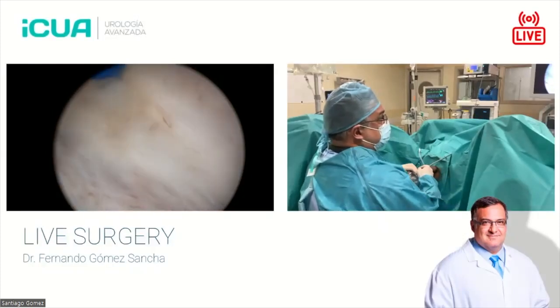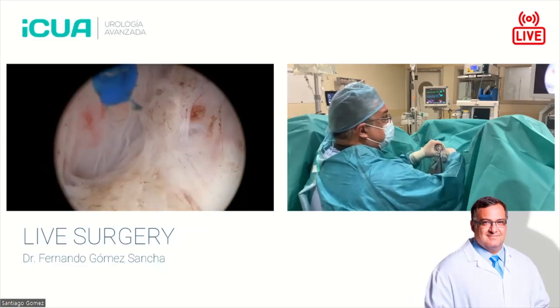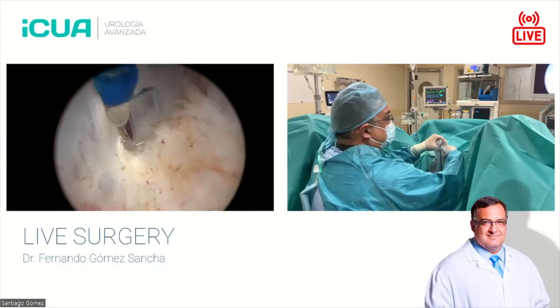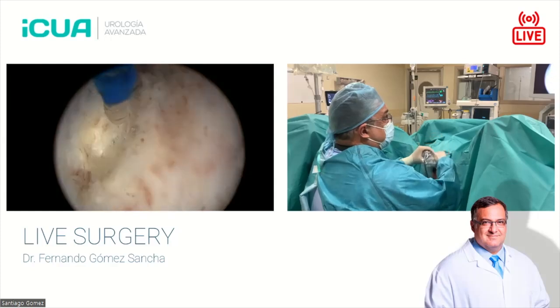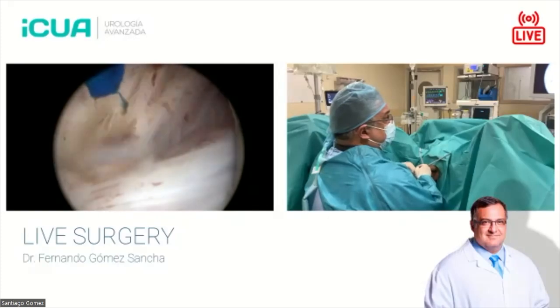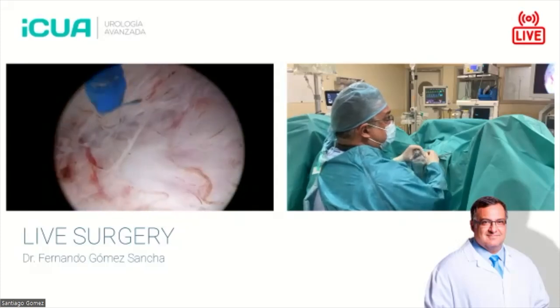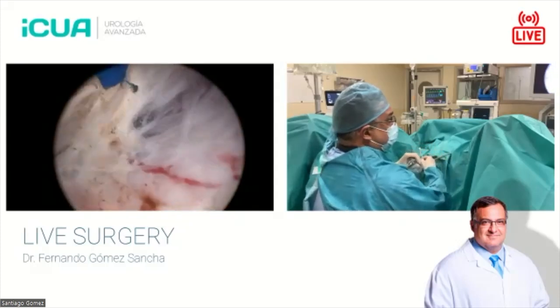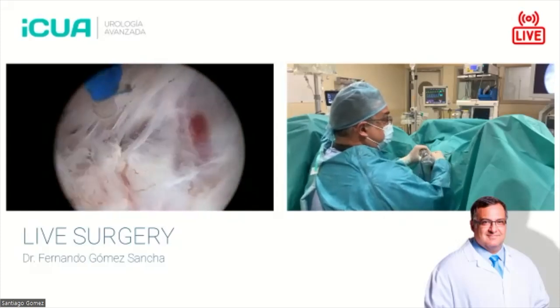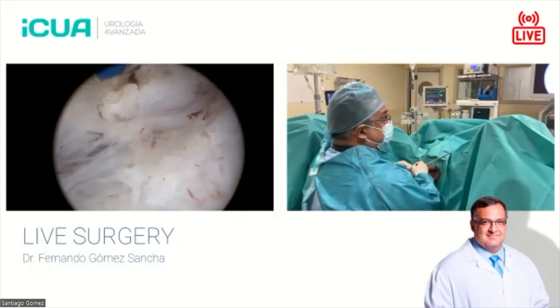Fernando, let's discuss the minimum energy, minimum laser power people can start enucleation with. Is a 60 watt laser enough, or should it be 100 or 150? What's your opinion? Well, you can work with low power. 50 watts is enough, I think. And usually in many 50 watt lasers, you cannot work with more than 40, 36 watts of energy, because they cannot withstand the continuous lasing time like this.